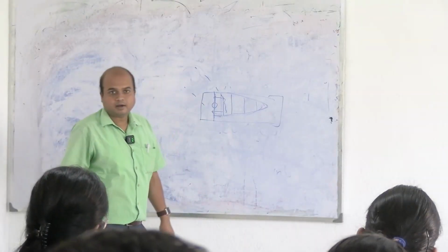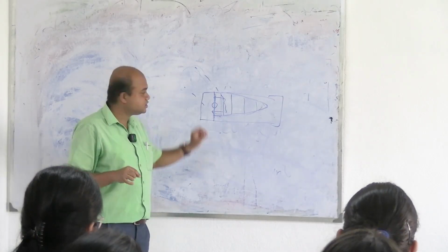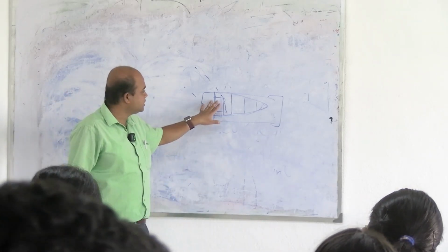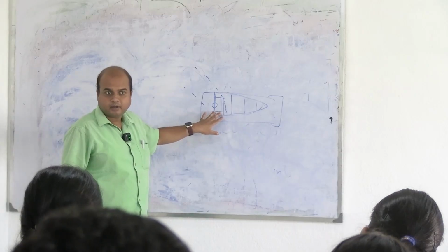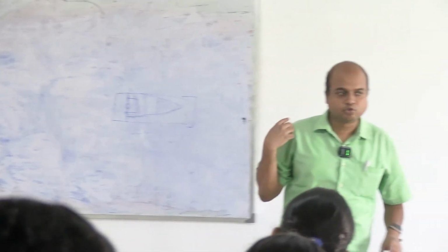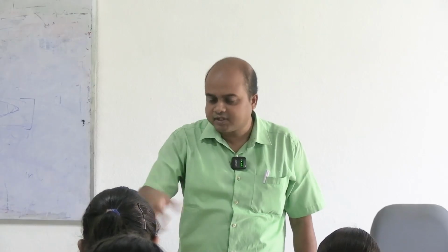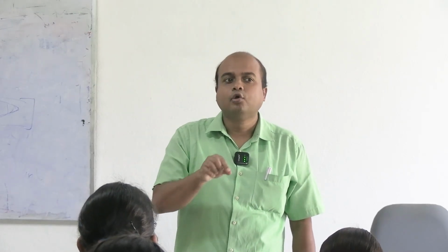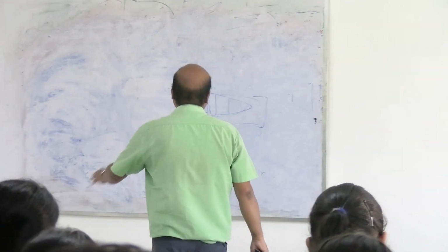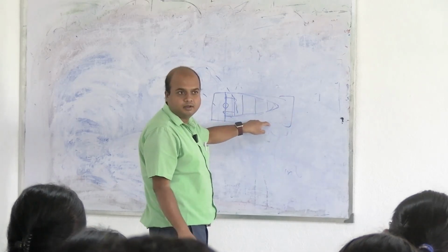Don't apply Leishman stain as you wish. Apply the Leishman stain drop by drop. There are arrangements for that. You have to apply Leishman stain such that it just covers the smear. In your initial days, the smears which we make may not be tongue shaped. Just see wherever the smear is and put the stain only over that portion on which you have drawn the blood smear. If the blood smear is up to this, then don't put stain over this area.